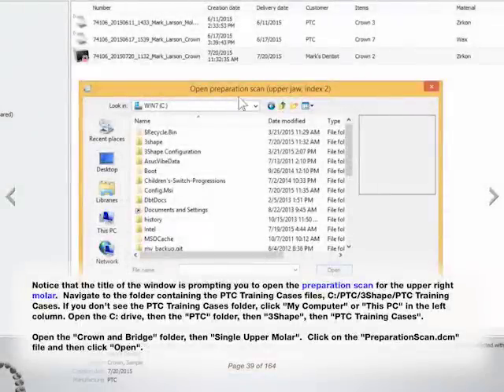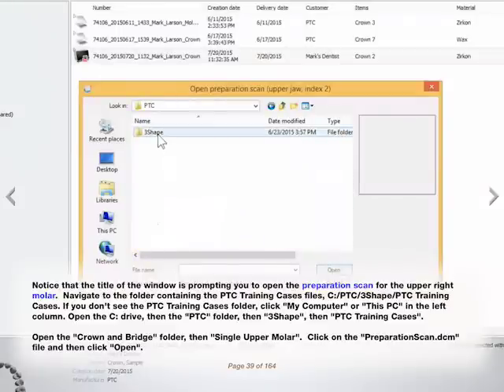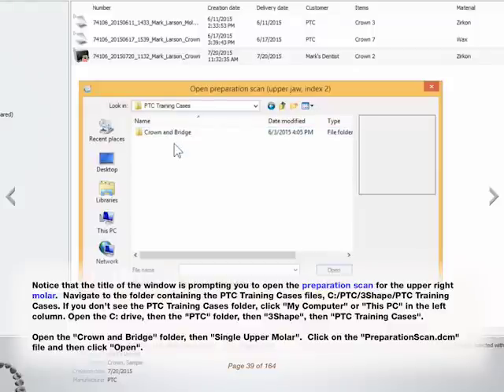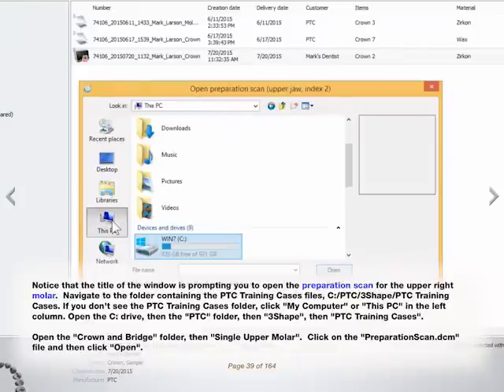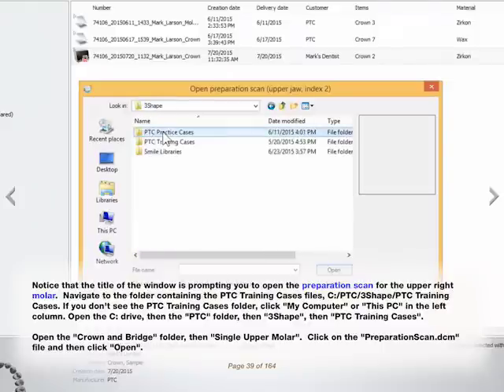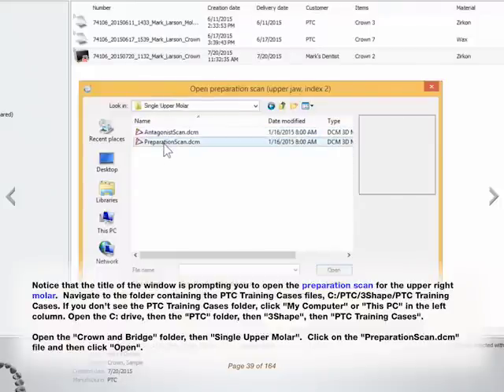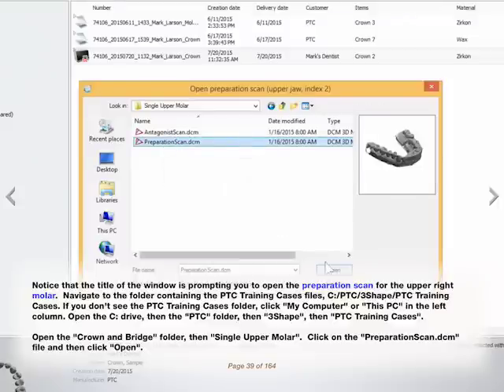Notice that the title of the window is prompting you to open the preparation scan for the upper right molar. If you don't see the PTC Training Cases folder, click My Computer or This PC in the left column. Open the C drive, then the PTC folder, then 3 Shape, then PTC Training Cases. Open the Crown and Bridge folder, then Single Upper Molar. Click on the Preparationscan.dcm file, and then click Open.